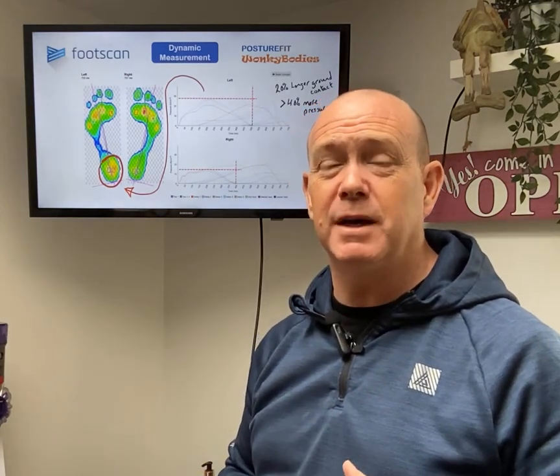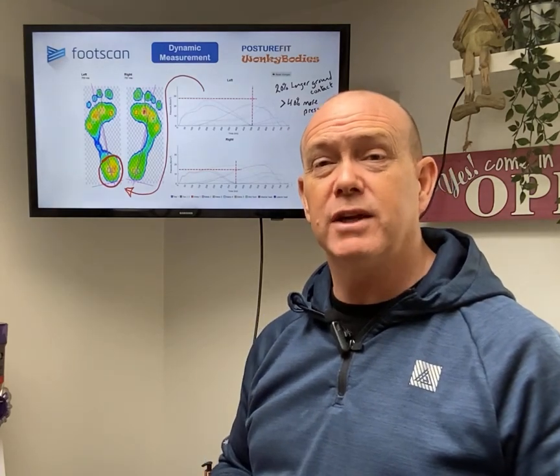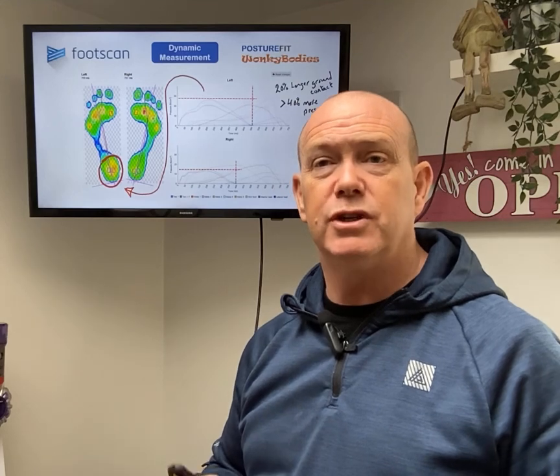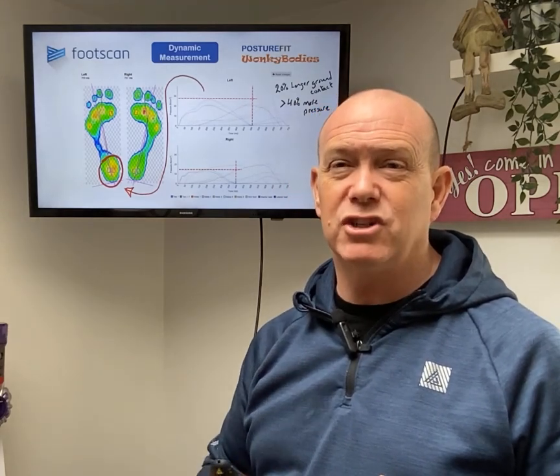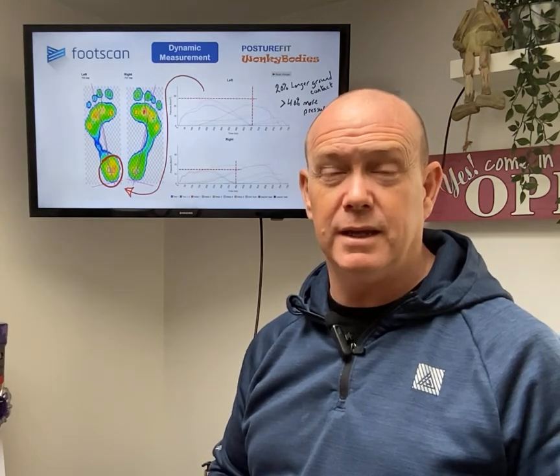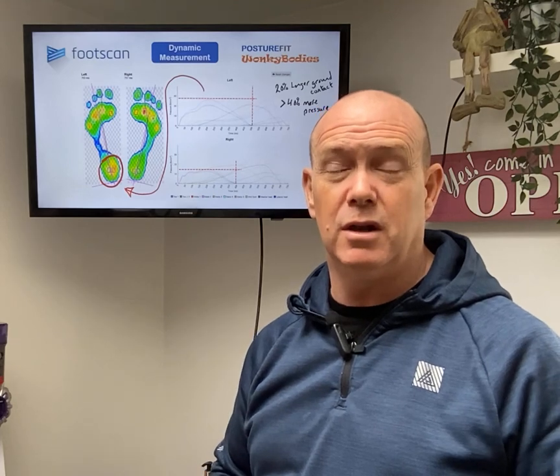Anyway, we can use that information along with the other tests and tools we use in clinic to actually devise a treatment plan, which includes muscle repatterning, biomechanical repatterning, to actually unload the foot that's got pain in it and start to load up the opposite foot to take up some of the load.